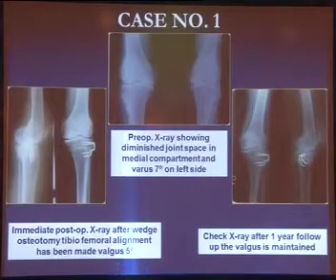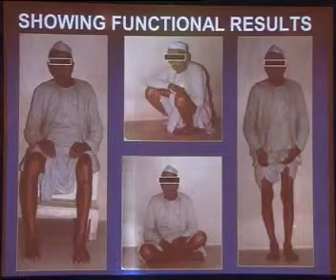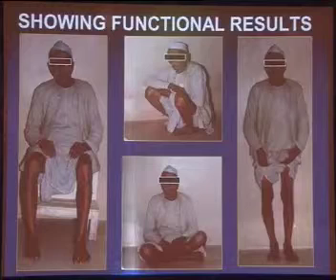Take x-ray after 1 year, valgus is still maintained. Now you can see the patient can easily squat and sit cross-legged.